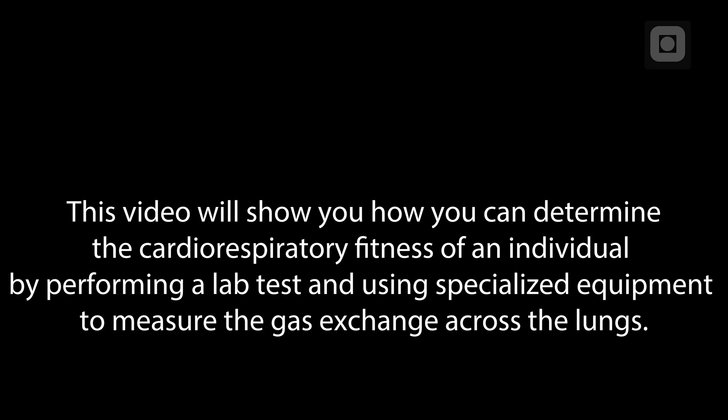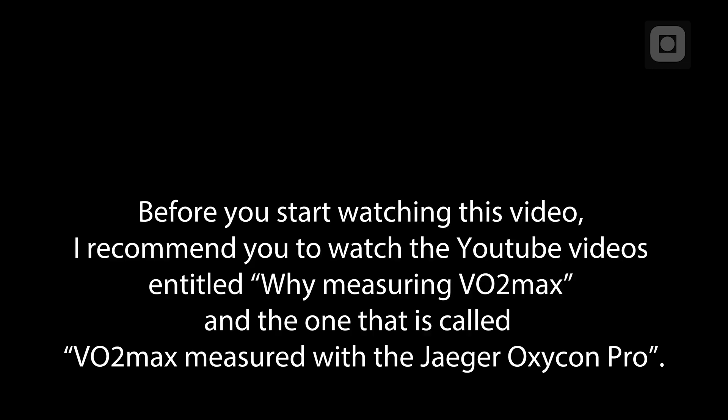This video will show you how you can determine the cardiorespiratory fitness of an individual by performing a lab test and using specialized equipment to measure the gas exchange across the lungs. Before you start watching this video, I recommend you to watch the YouTube videos entitled 'Why Measuring VO2Max' and the one called 'VO2Max measured with the Jaeger Oxycon Pro.'